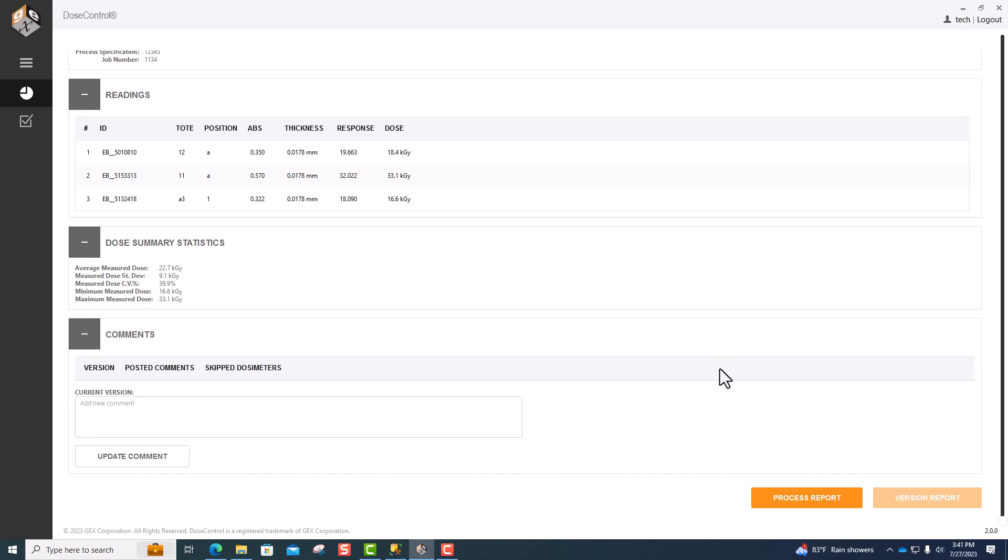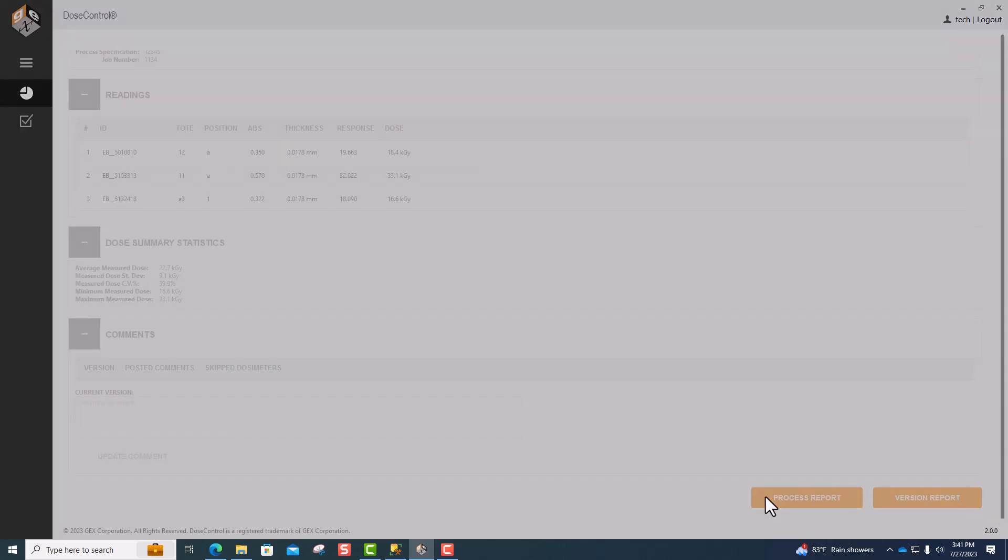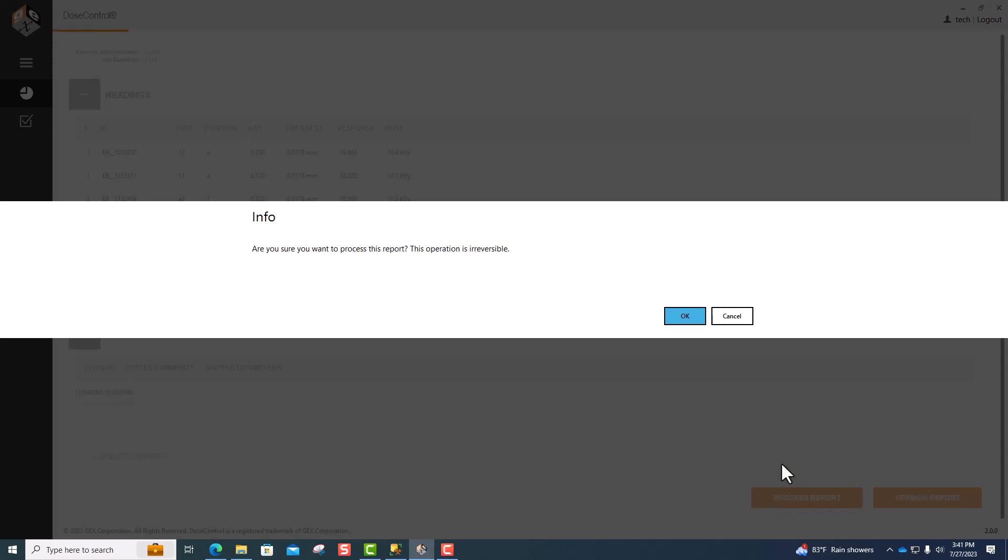If all of this information looks good, you can process the report, which locks all of the information and all readings and information becomes uneditable.